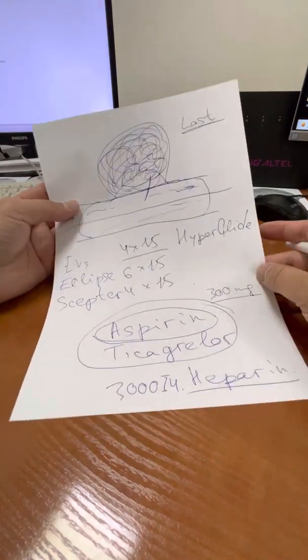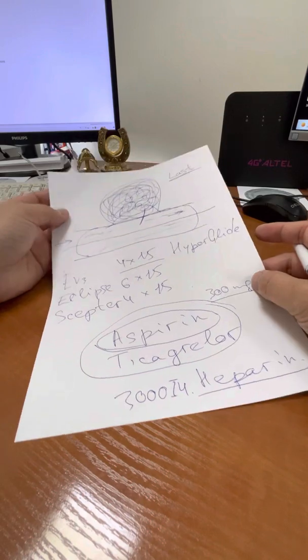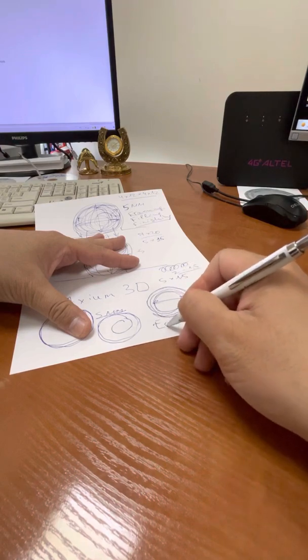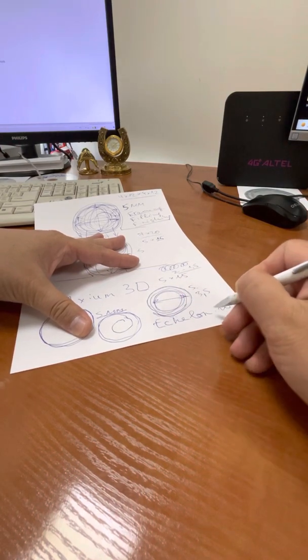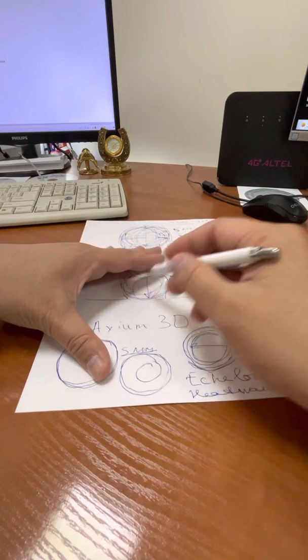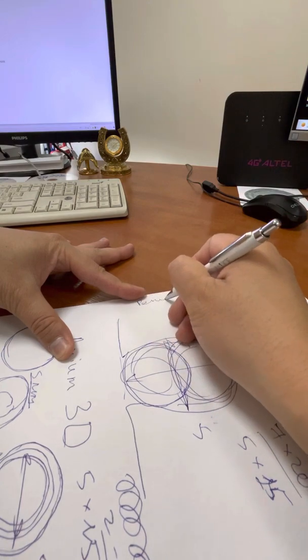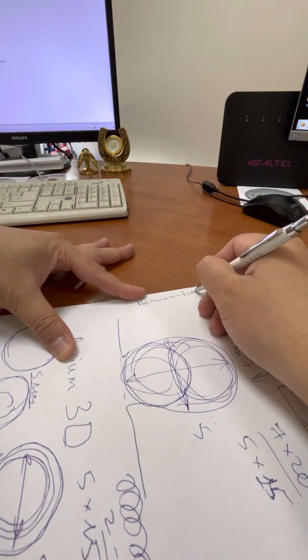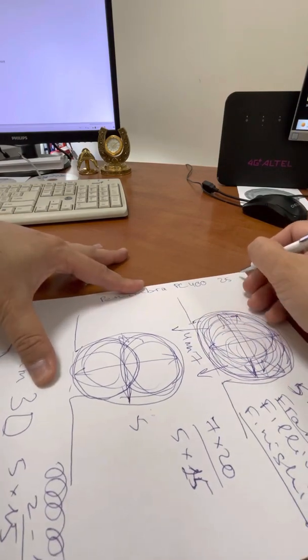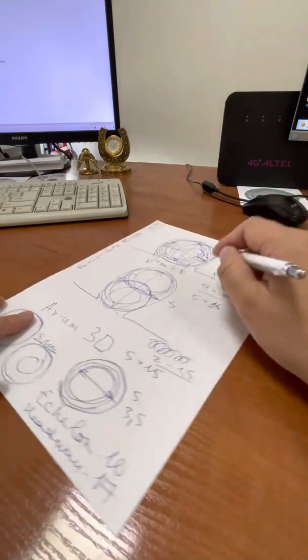Okay, if you have some questions, I will answer. All coils could be delivered through the 17 microcatheter, or Echelon 10 is a 17 microcatheter, or Headway or Gamma 17. All these types of coils could be delivered, and only one coil should be delivered through the 25 microcatheter. It's the Penumbra PC 400. You need a 25 microcatheter. It's bigger, nearly 2 times.